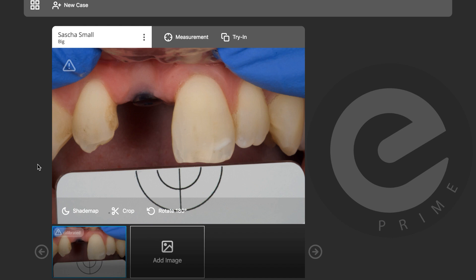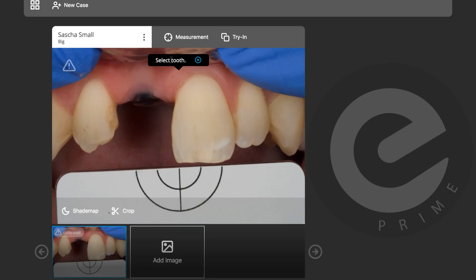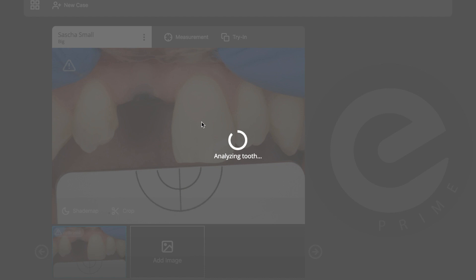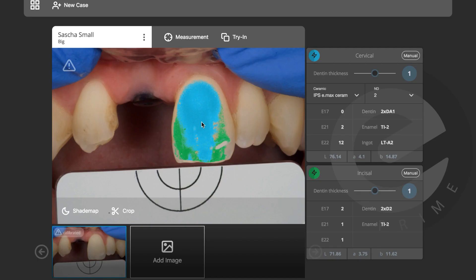Now we need to measure the shade. I'll click on the measurement tool and it's asking me to select the tooth. The software already recognizes the tooth, so I'll click on it and it will calculate the shade mixture for me — again very easy and simple, taking about 3–4 seconds.